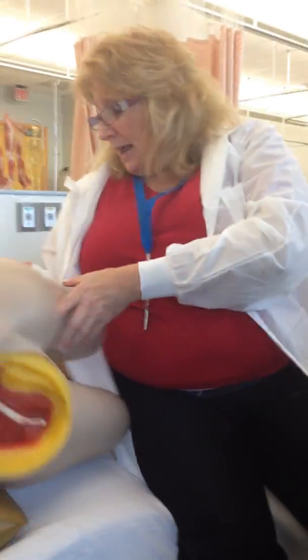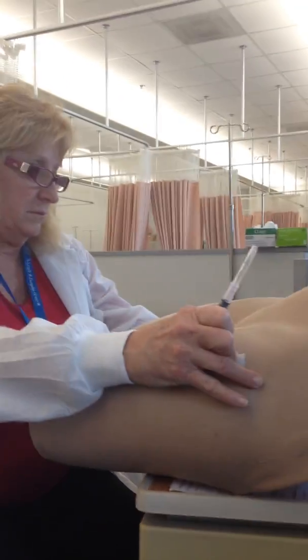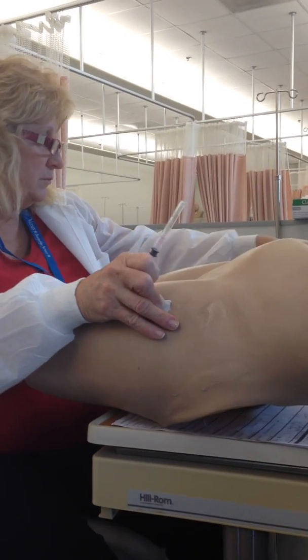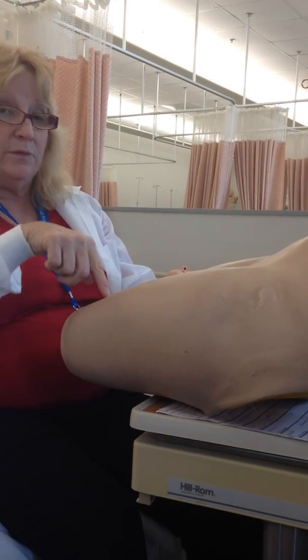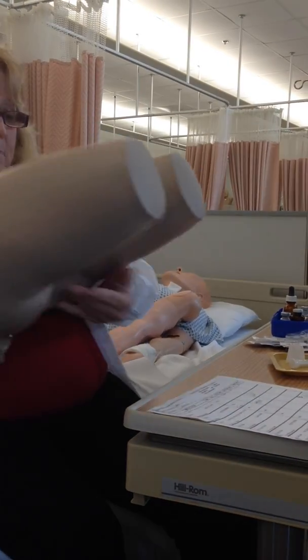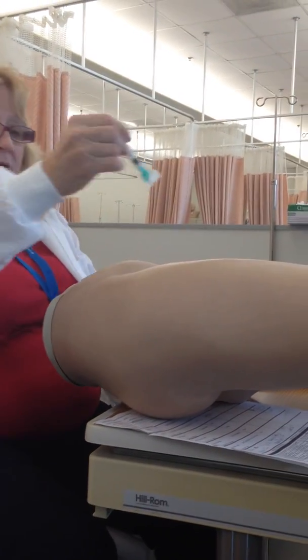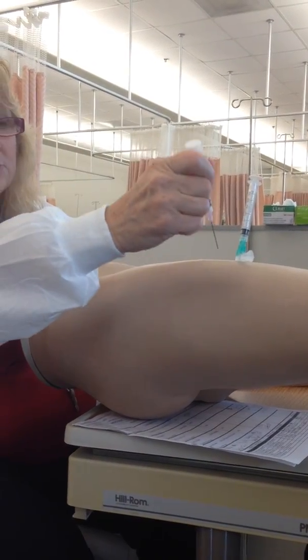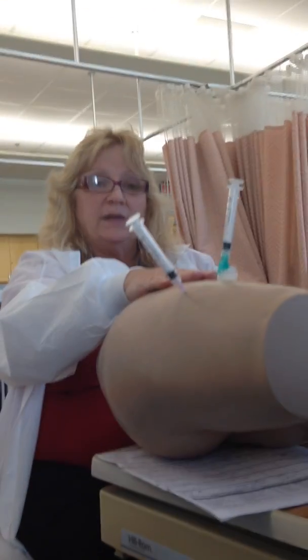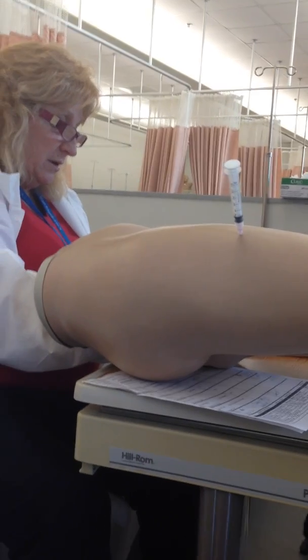Okay, so the last 2 injections, these are all intramuscular, right? That was intramuscular. This is the rectus femoris, okay? Rectus femoris is right there on the front, in the middle of the thigh, and the other one is right about like that. We have rectus femoris, vastus lateralis. Given the same technique, aspirate always on intramuscular.